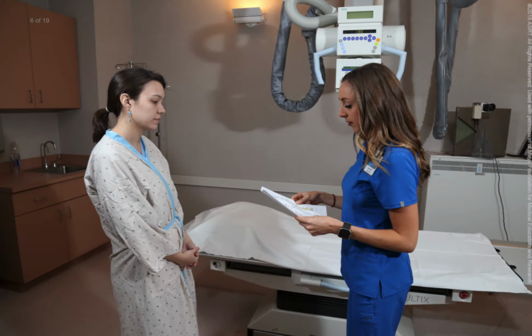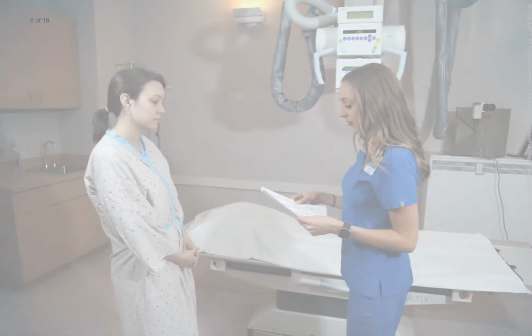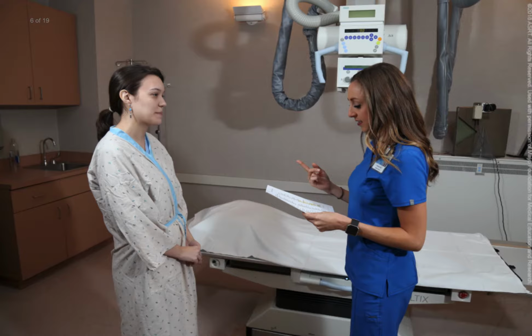Clear communication with a patient will ensure that a proper patient history is acquired and that the patient will comply with all instructions. It is generally good practice to explain the procedure to the patient before exam positioning so that any questions can be answered immediately. When examining the pelvis and hip, it is especially important to advise the patient of the palpation methods that will be used to localize anatomic structures before positioning begins.